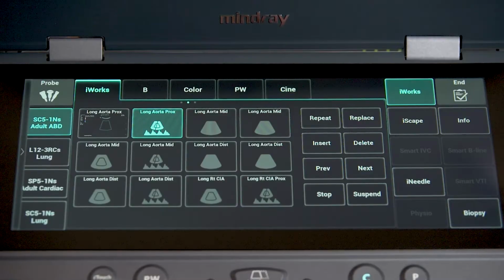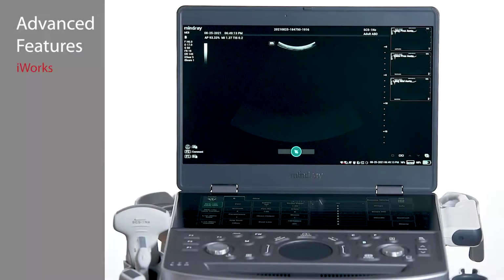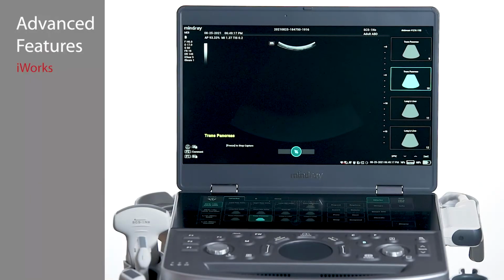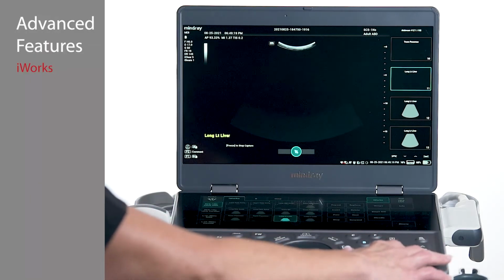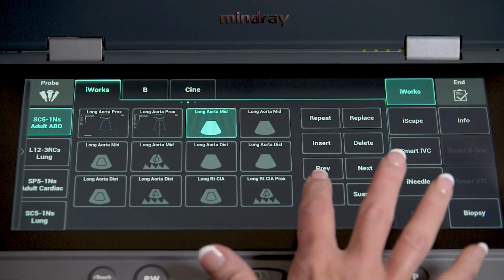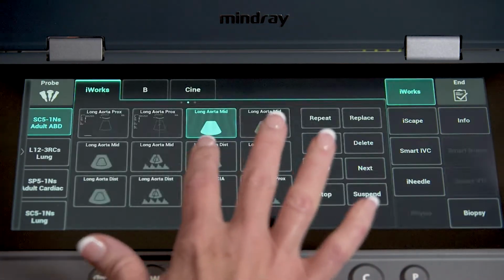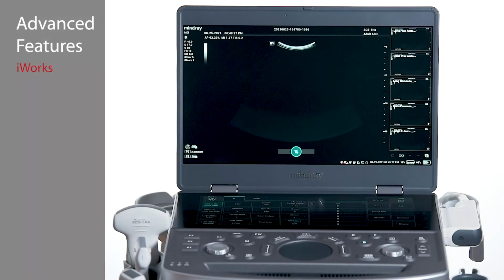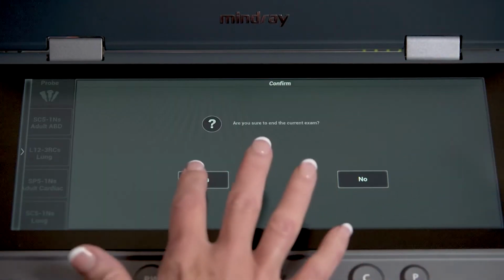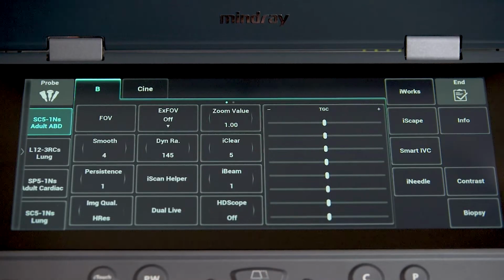To pause, tap the Suspend tab. To resume, tap the iWorks tab again and the protocol will pick up where suspended. Continue until complete. The Stop tab ends the protocol but does not end the exam. Continue to scan the patient outside of the protocol if necessary. When ready, tap End to close the study.